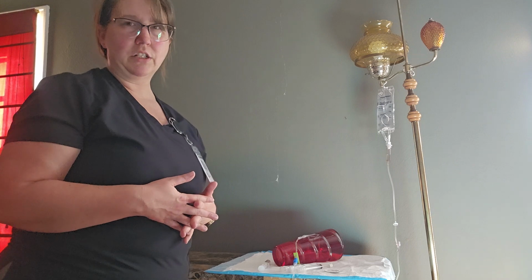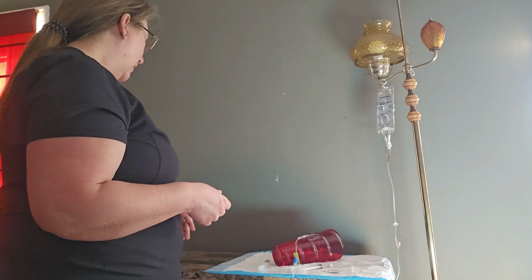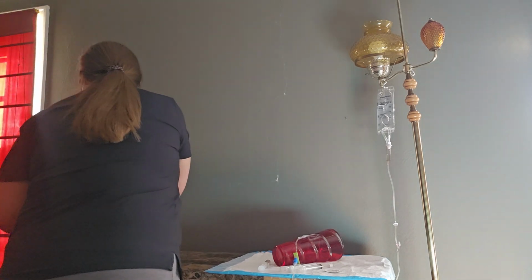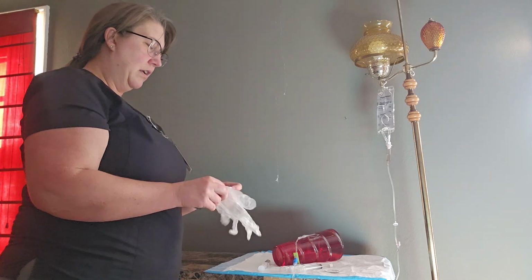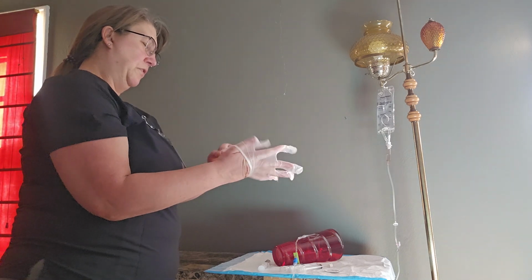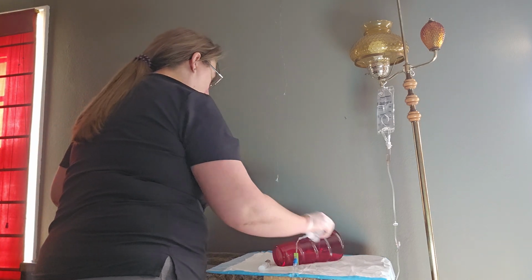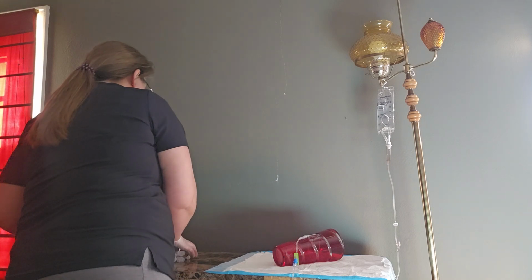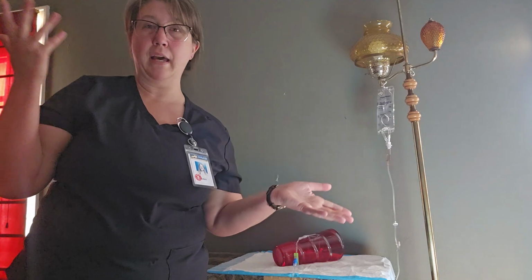and that'll be in about 15 to 20 minutes because it was a medication. And I'm going to clean up my area and put everything in its appropriate container. So I'll just put a glove on again. Clean up my area, and I'll go and document. And like I said, I'll be back in about 15 to 20 minutes to check on my patient, see how they're doing.